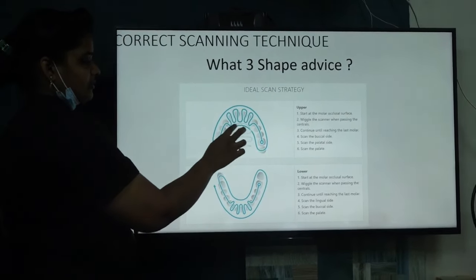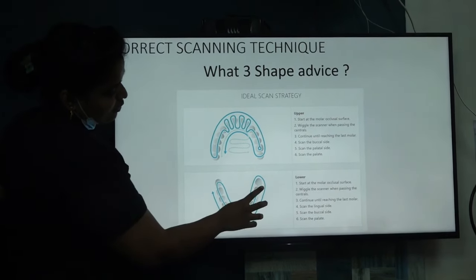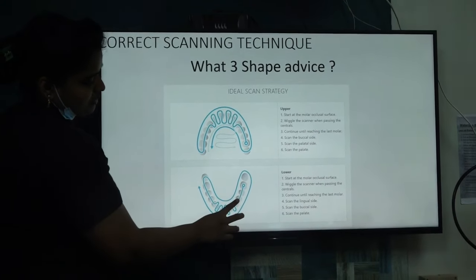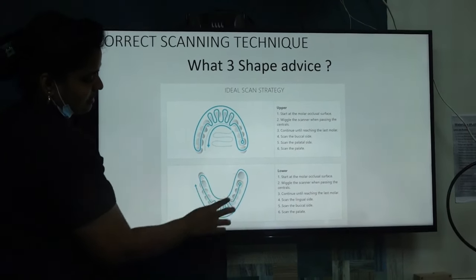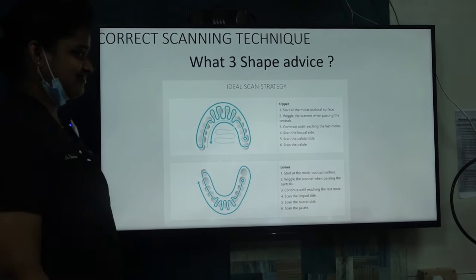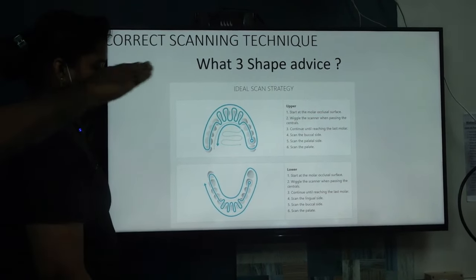Then lingually, and palate. Then reach the palate. Same for the lower: you have to start from the molars, go through the occlusal surface. Same technique, that's all. When it comes to anterior, you have to do like this. Then occlusal, then cover the lingual, then buccal.